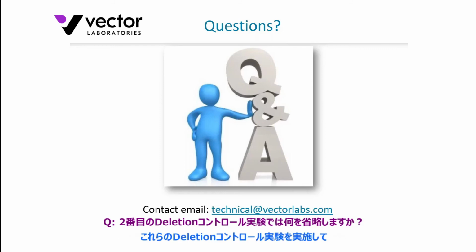And then after that, I said, put everything together and see if you still get inappropriate staining. And indeed, if you still get inappropriate staining with everything together, the primary, the secondary, and the enzyme substrate, but you did not see staining with the first or second deletion control, it tends to indicate something associated with that primary antibody is generating the background, either the diluent possibly, or the concentration, or something about the antibody that may be recognizing other epitopes beyond that target antigen that you're looking for.